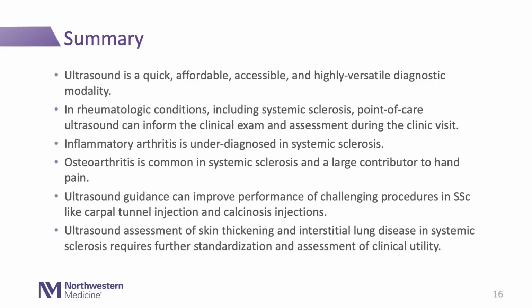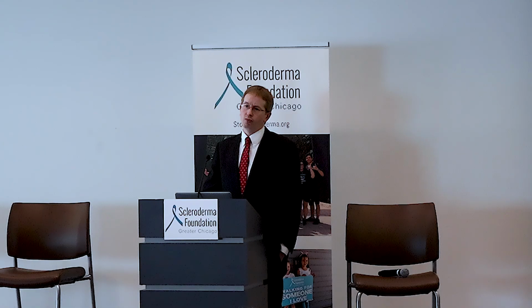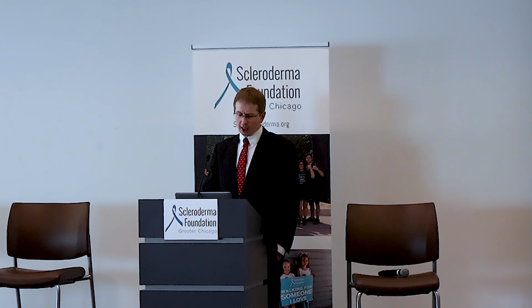So to summarize beyond what I just said, ultrasound is quick, affordable, and accessible. You can do it right there in the clinic, piece of cake, if you're trained. And it has a lot of different uses in terms of what it can diagnose. Rheumatologic conditions, including scleroderma, point-of-care ultrasound can tell us what is going on in this joint that hurts, and you can start talking about that right there the next minute with your rheumatologist.